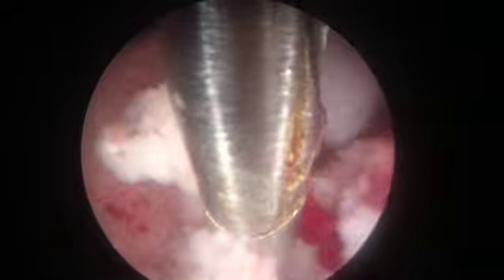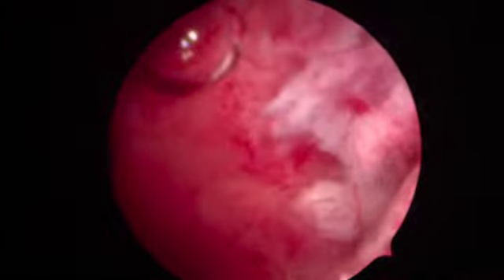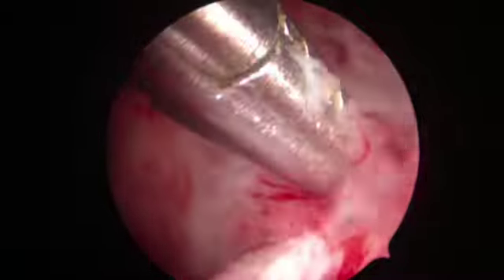Here again the principle, since we are working in office, is instead of pulling and pushing the grasper, just shift your hand on the scope to one side, that avulses the tissue and you get a proper retrieval of the tissue. Similarly, we will remove all the small excrescences which are seen coming from the posterior wall and subject them to a proper biopsy.